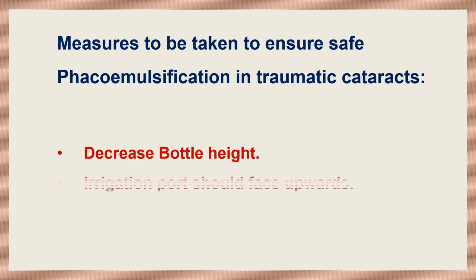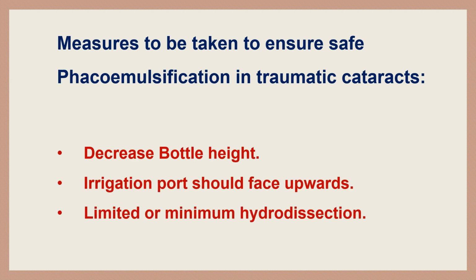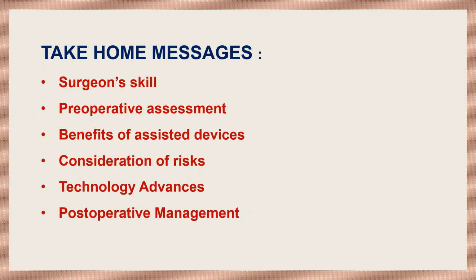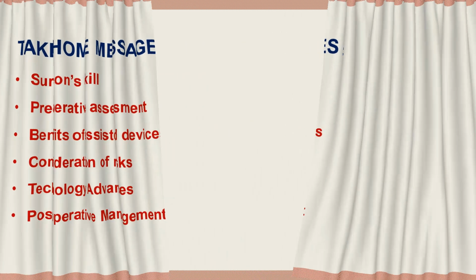So, to ensure safe phacoemulsification, bottle height should be decreased, irrigation port should face upwards, and there should be limited hydrodissection. These key takeaways highlight selection of the most appropriate approach, emphasizing patient-centered care and surgical precision.